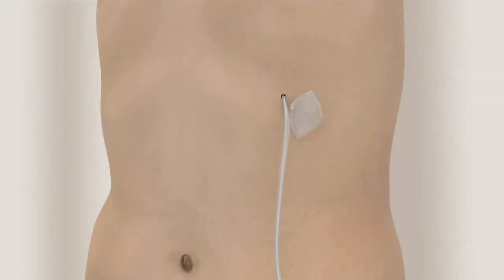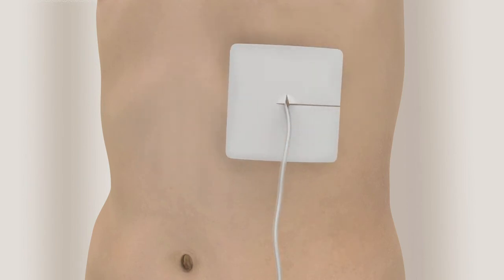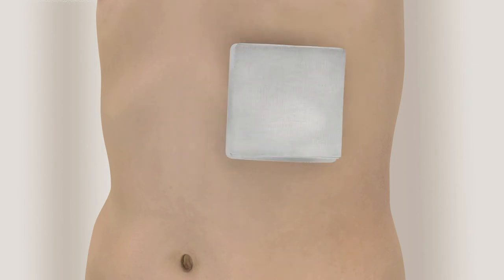Clean the skin around the catheter using the last alcohol pad. Place the foam pad around the catheter. Wind the catheter in loops and hold it on top of the foam pad. Then, place the gauze pads over the catheter.